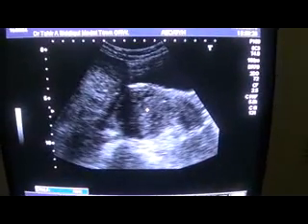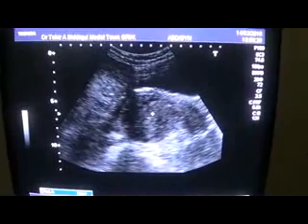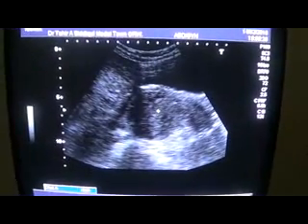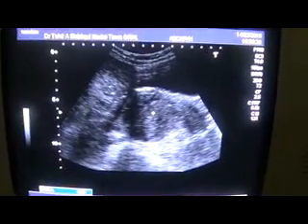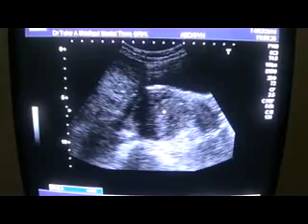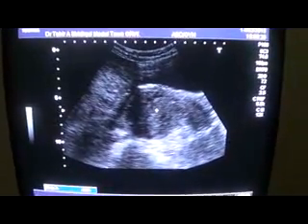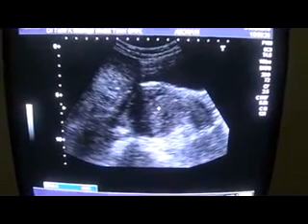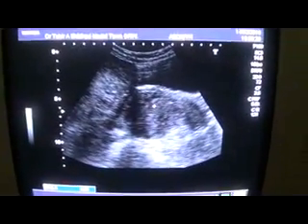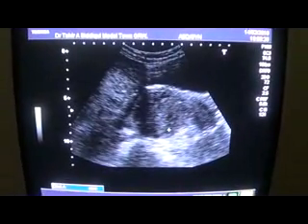This is a frozen image of the pelvis of a 45-year-old female. She is menstruating, with no history of any menstrual disorder. The reason for the scan is a protruding abdomen, and a hard mass felt in the abdomen for the last few months.